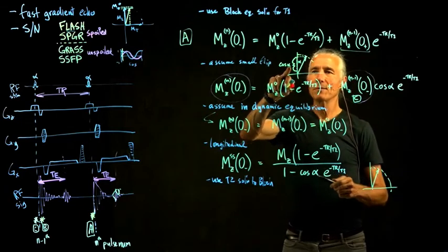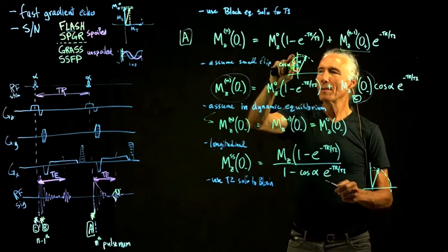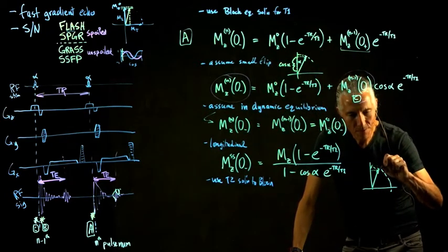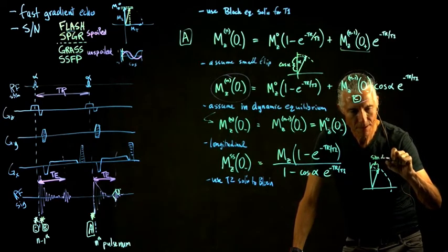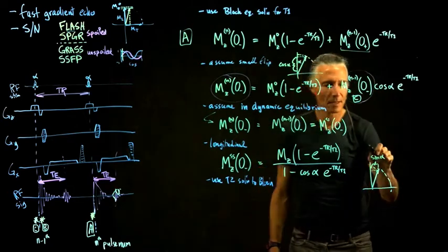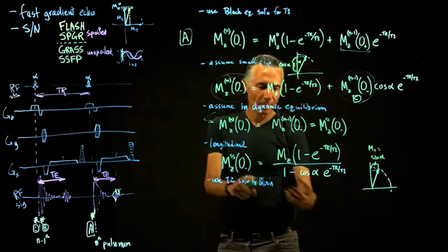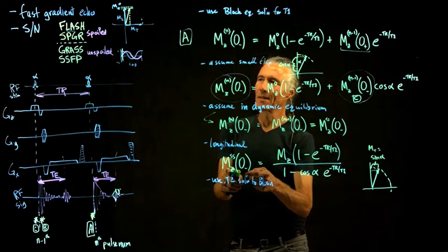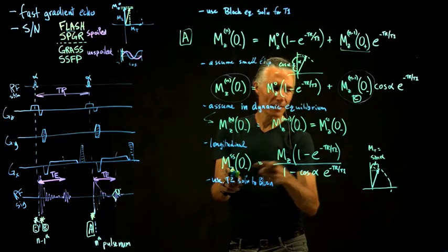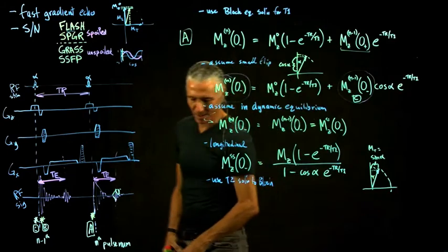In this case, we found that the cosine is what gave us the amount of remaining longitudinal, but over here is going to be the sine, and that's Mt. So we need a sine in there because we have to multiply this thing by a sine, since we're not turning all of the longitudinal into transverse, just however much according to whatever flip angle we used.